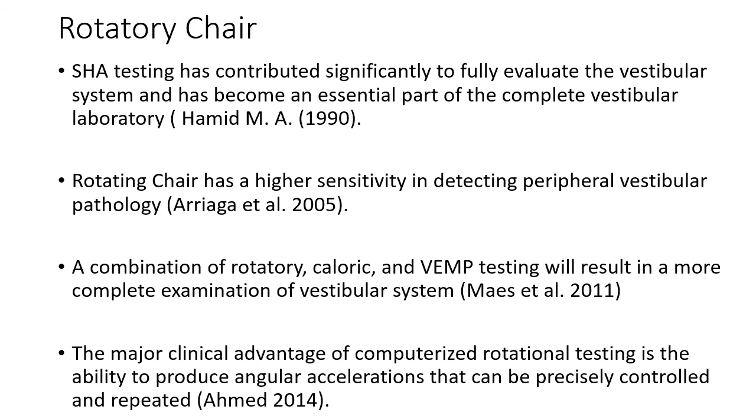Also Mais et al. 2011 agree with the earlier study by Hamid, suggesting that a combination of rotatory, caloric, and VEMP testing will result in a more complete examination of the vestibular system. Maybe it is because the major clinical advantage of this rotating chair is that it uses computerized rotational testing, which is able to produce angular acceleration that can be controlled precisely and repeated.